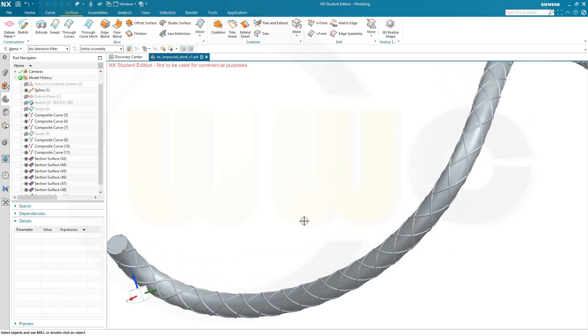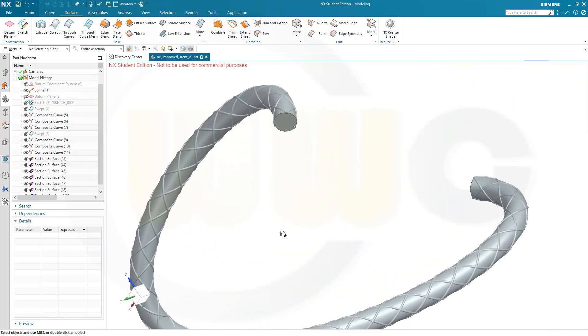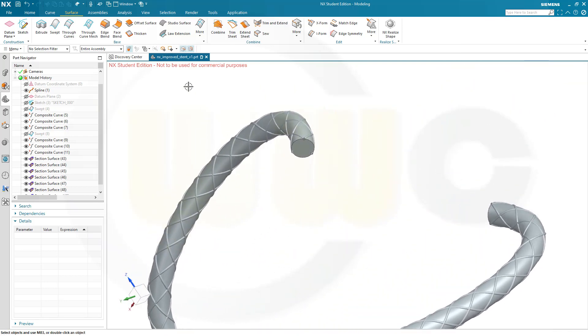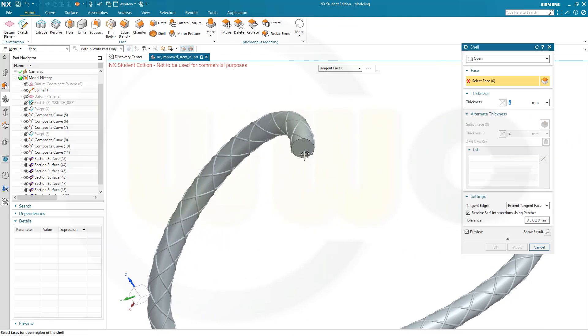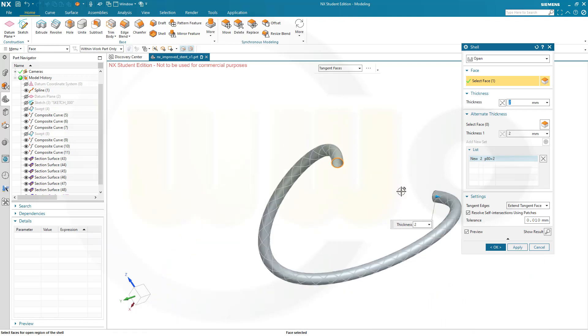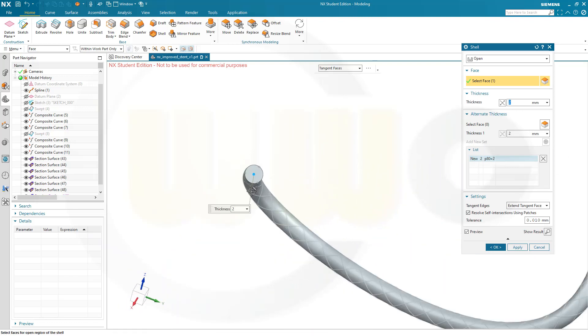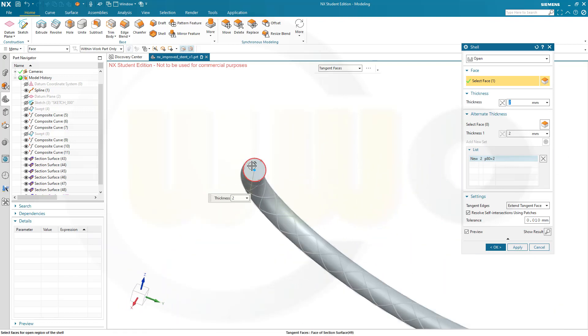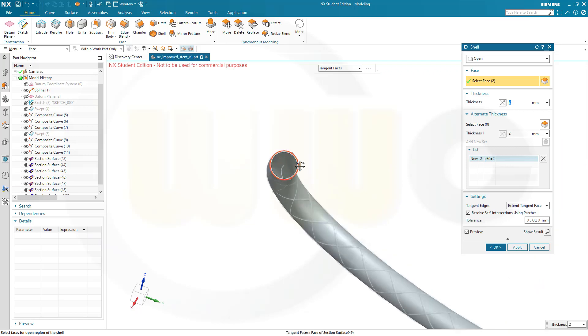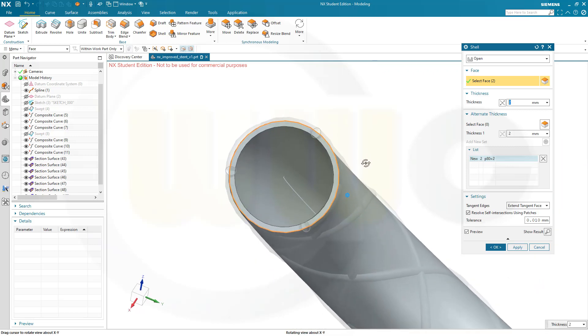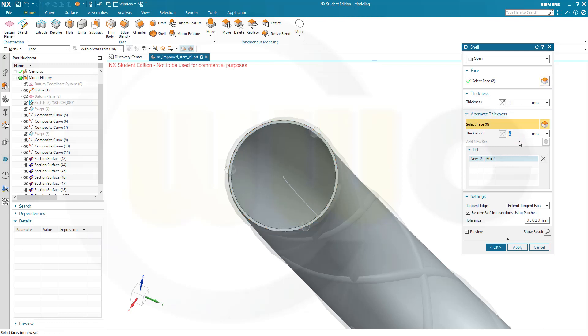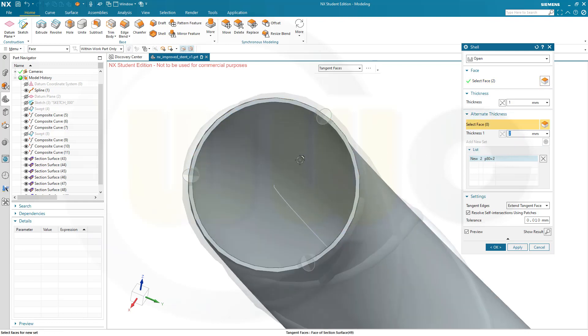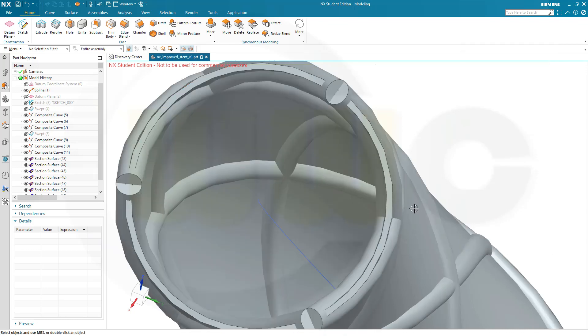Now I want to use a shell. So go for Home, go for Shell. I want to remove this surface here and of course that one. Let's take a closer look. Let's go for a thickness of 1 mm. Now the first one, like that. This looks good, and confirm.